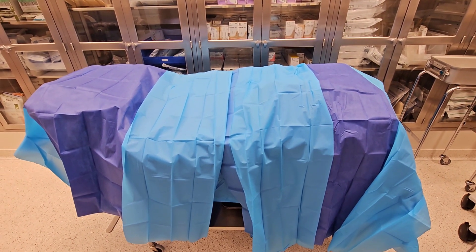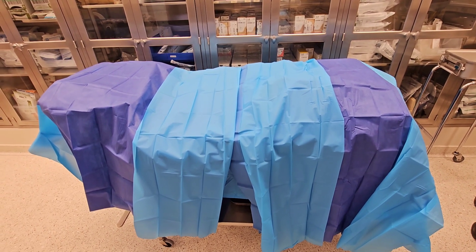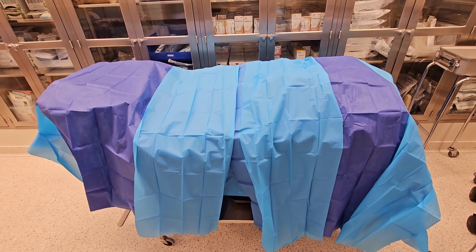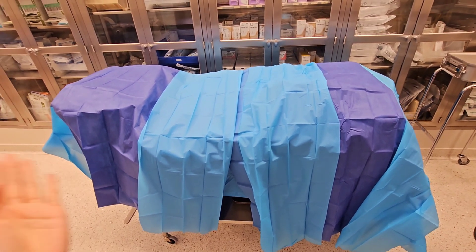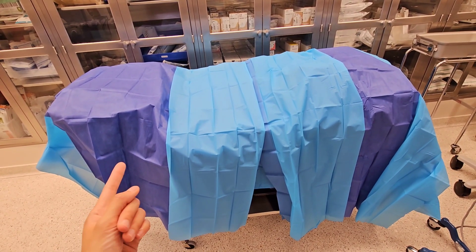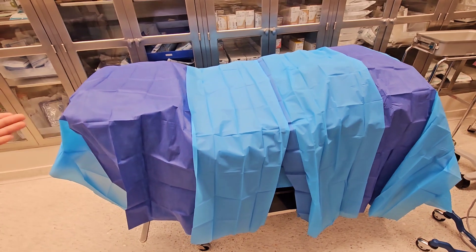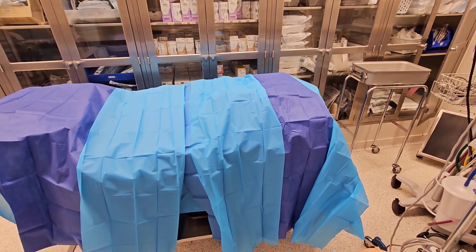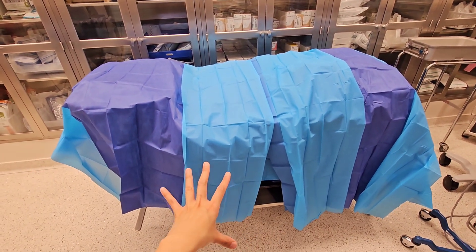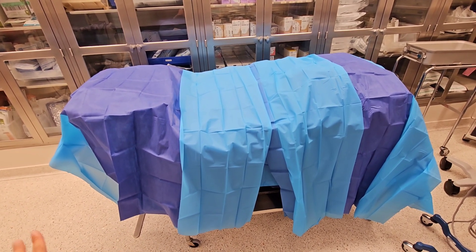And if you've seen my Instagram post, there is absolutely very little chance that you can actually execute that properly — you've got to make moves for that one, and I have to show you that in a drawing or something, and how me and the other scrub tech figured it out. But this is how I would do it if I were to cover my table and if I don't have a Z drape. You can remove this either sterile or unsterile — you can scrub in and have your nurse pull it back this way and that way. Just imagine how it's going to roll this way and that way — nothing from the bottom area is going to come up.